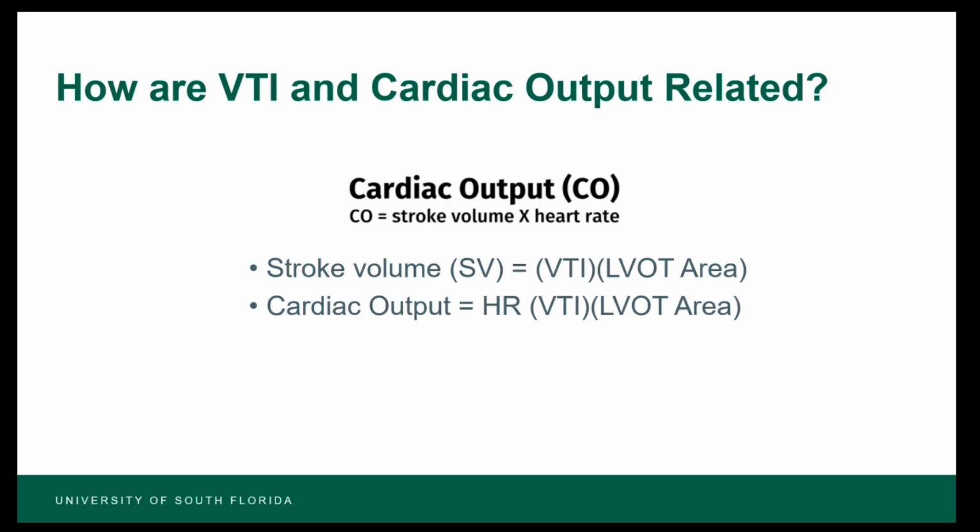And again, this is a non-invasive measurement that's often useful in guiding fluid management in sepsis and getting some real-time calculations. And Dalan's going to talk a little more in depth about how to actually get that VTI now.